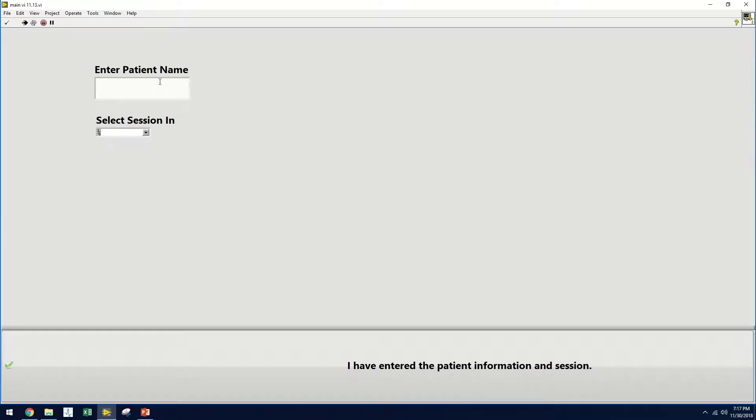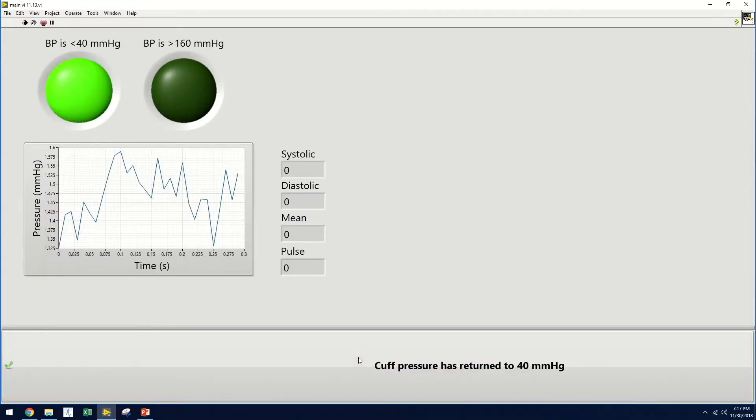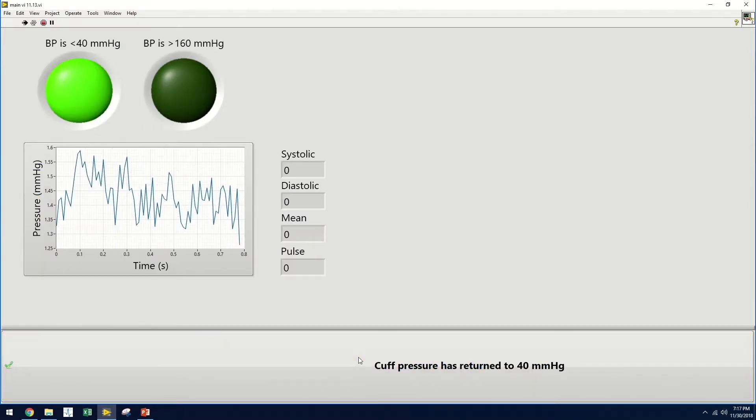So let's just show you how this works. The user, a medical professional in training, will first be prompted to enter the patient name. This will be used to create or locate the patient profile, which will save relevant information like vitals and the successful vein image. They will then select the camera session and indicate that they have entered all this information.